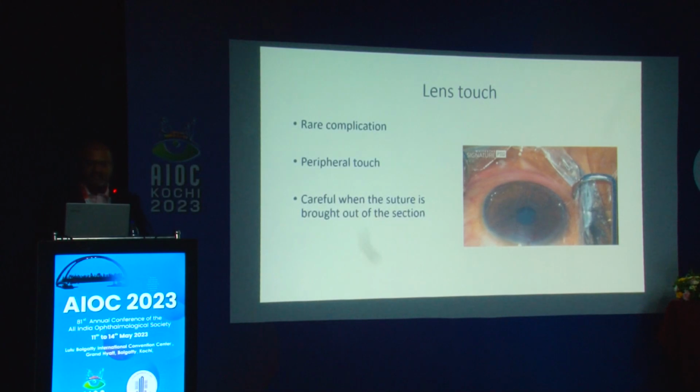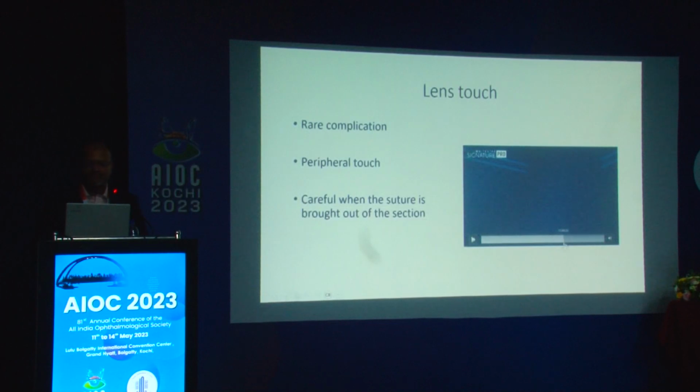Lens touch hasn't happened to me so far, thankfully, touch wood. It's a rare complication. You can have a peripheral touch. Careful when the suture is brought out of the section. Sometimes you have a whip sort of an effect. When the suture comes out, it comes out in a whip fashion. So be very careful with that.